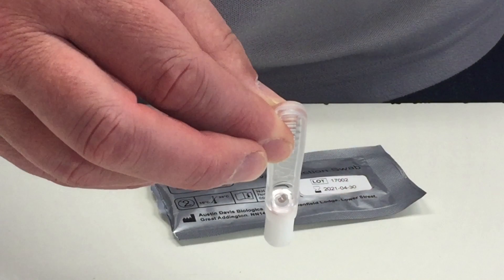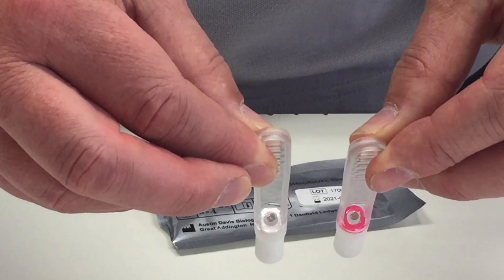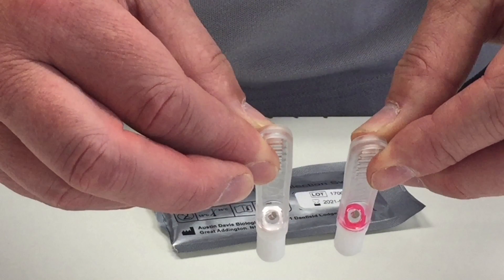The window for viewing the colour change is in between the handle and the absorbent end. It is white to start with and changes colour to pink when enough sample has been collected.